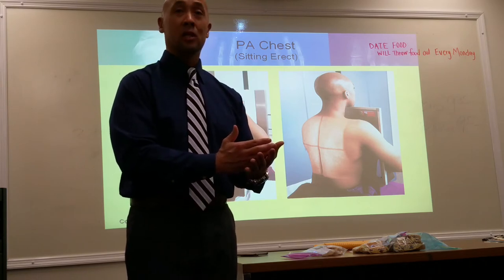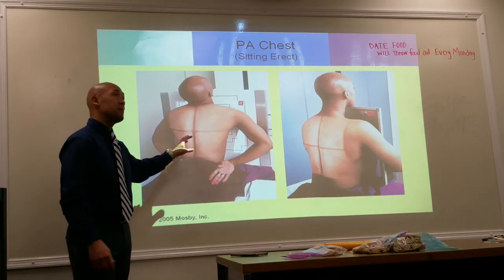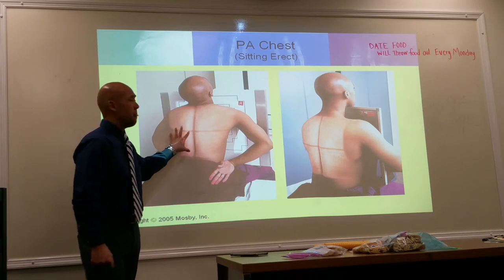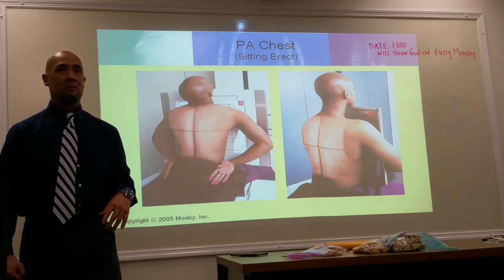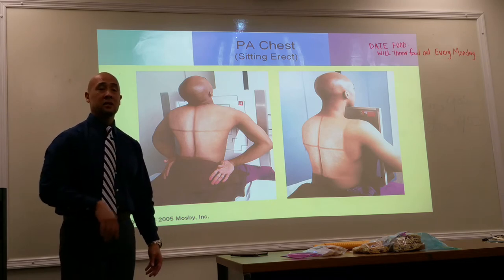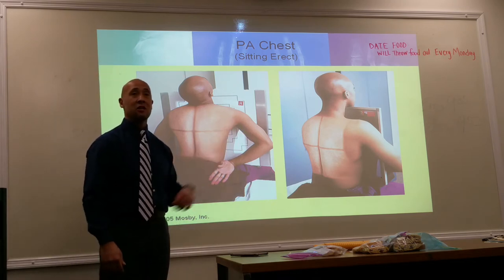Yeah, it's gonna be lower, yeah. So my KV is gonna stay the same. Like if I use a grid, I'm gonna probably use about 110 at about 8 to 12 mass on an average size patient. If I did it without a grid, KV is gonna stay the same, and cut my mass dramatically. Or I can keep my mass the same and cut my KV dramatically.